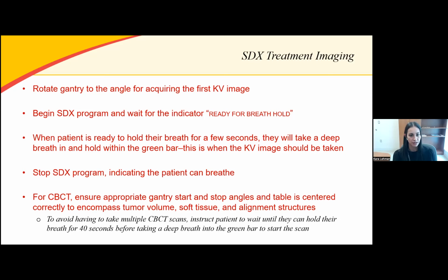But just be sure that whenever you're ready to take a cone beam, if this is a day that you have to take a cone beam per what the doctor's requesting, you let the patient know that this will be the longer scan, so that the patient knows they need to be ready and maybe take a few more regular breaths until they feel ready to hold their breath for as long as the cone beam takes at your specific clinic.